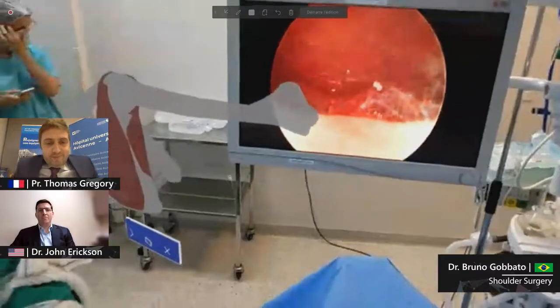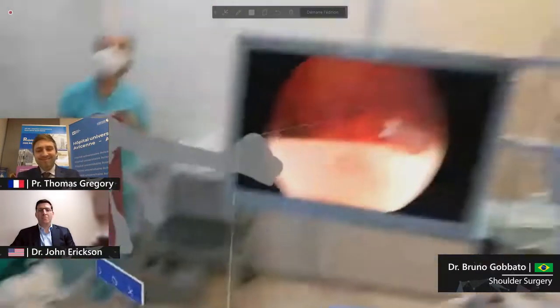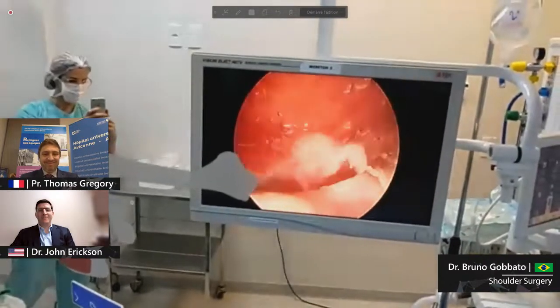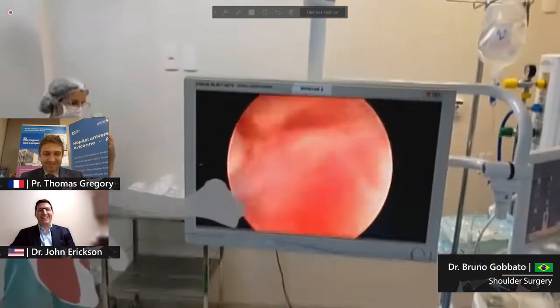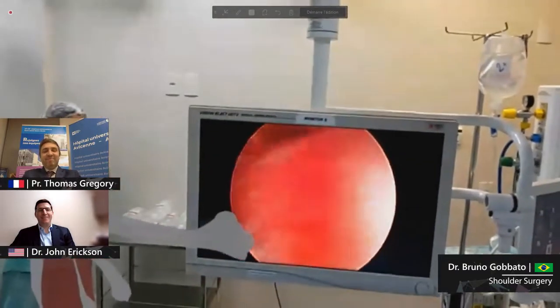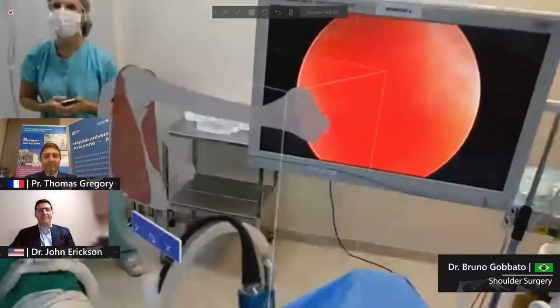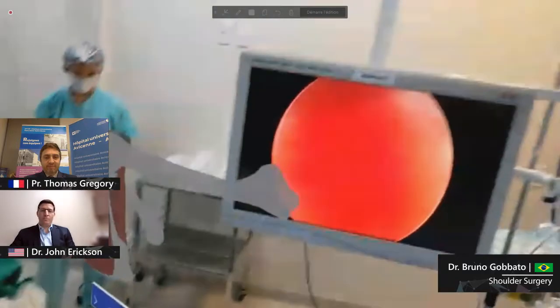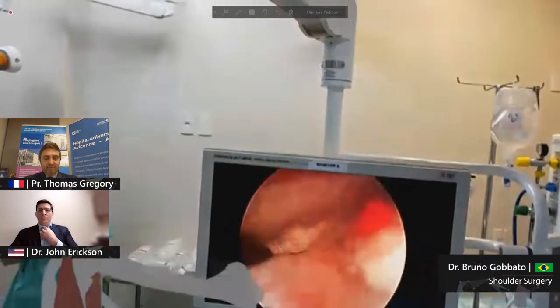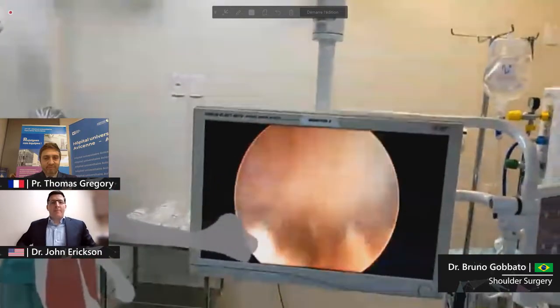Now he owns his own hospital, so now he can lend me his models, whatever I need. But this is not a patient-specific model. All the models that you have seen today were from this patient actually. This is the only model that is not from this patient. This is a model just for teaching.